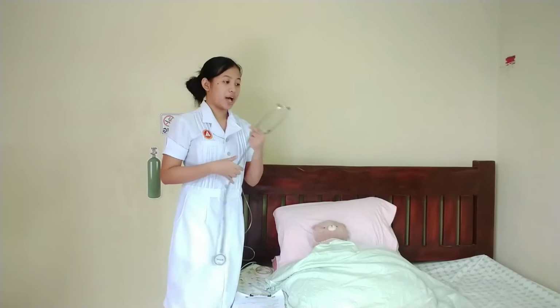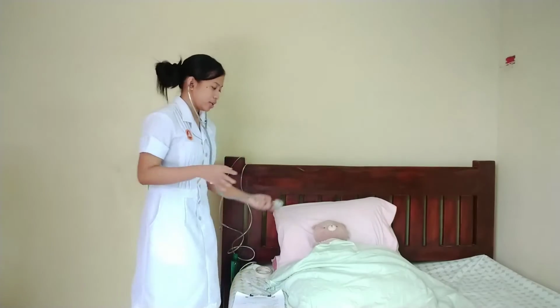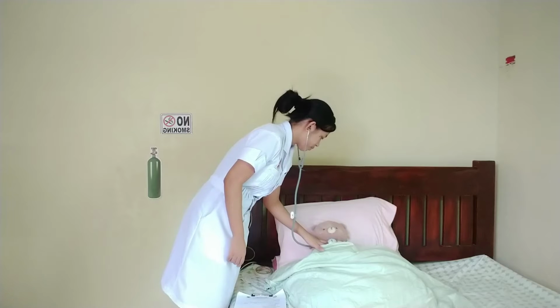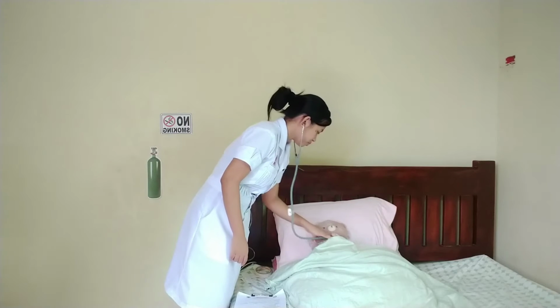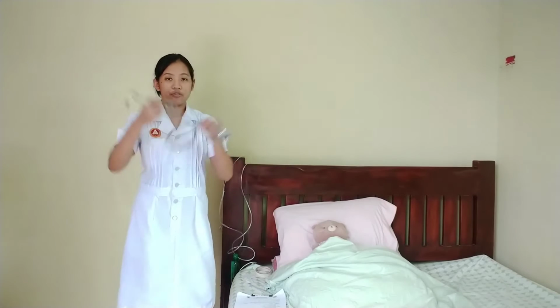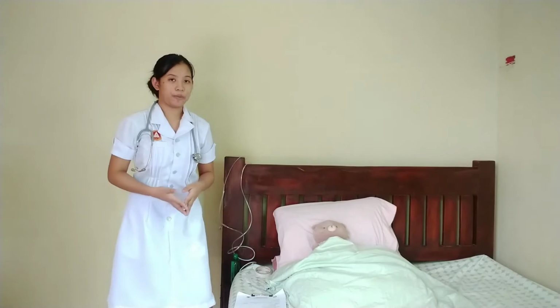So I will use a stethoscope to auscultate. And then also I will be checking for any presence of clinical symptoms of hypoxia and hypercarbia.